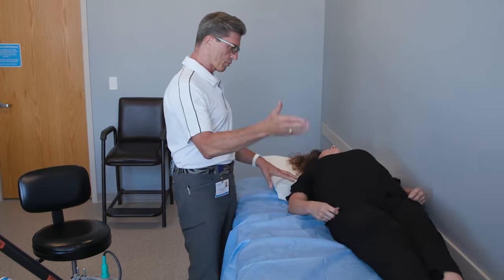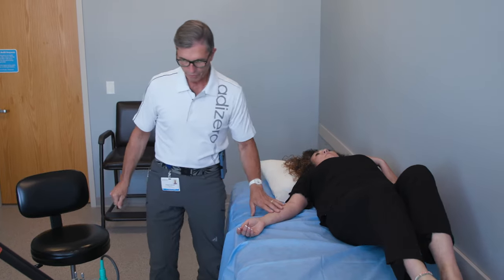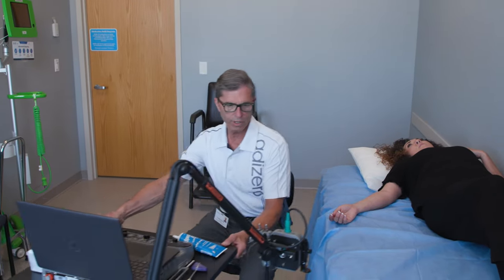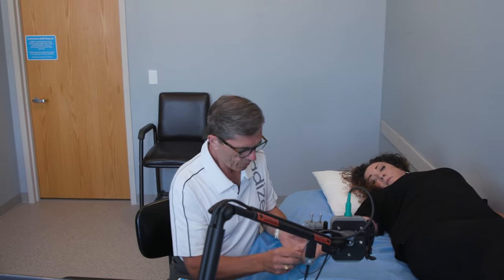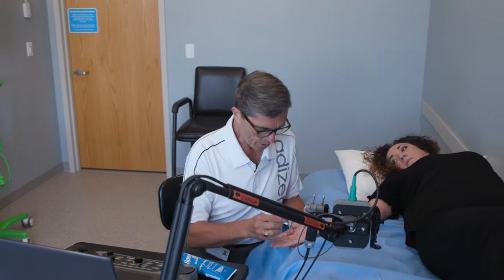If your back gets sore, you can bring your legs up. You don't have to keep them down if you're uncomfortable. We're going to first measure your arm because the measurements are critical. We're timing things down to within one hundred thousandth of a second, so we have to give the computer some accurate measurements. We're going to take some measurements first before we get started.